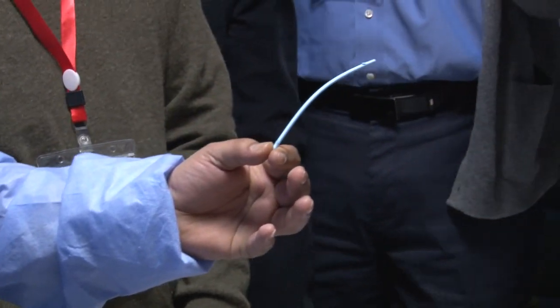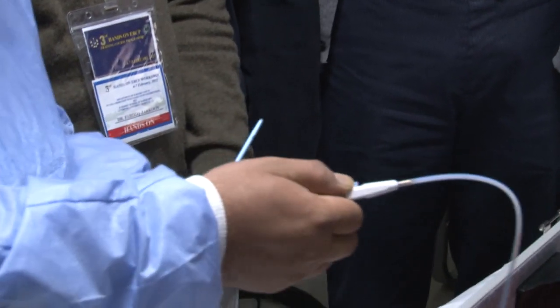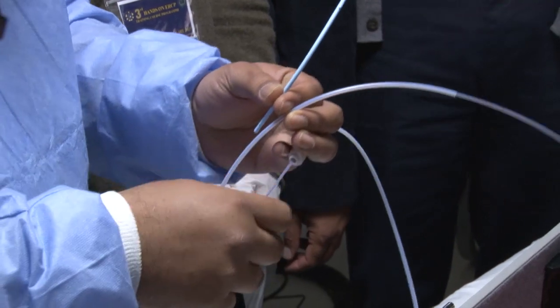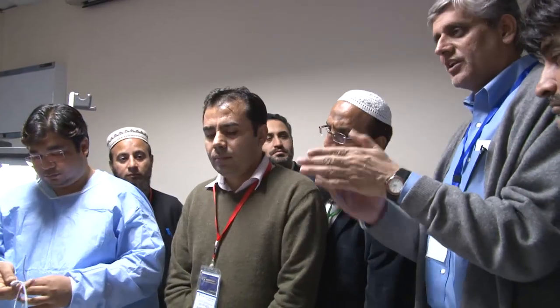One of the problems that you have when you see people struggling and the stent is not going up is because you are not actually coordinating these movements. The most difficult of strictures are made even more difficult because your coordination is not there.